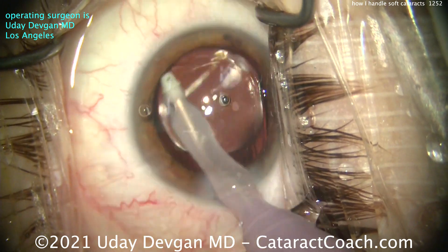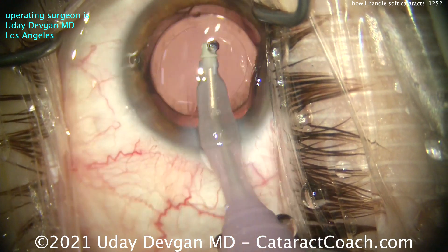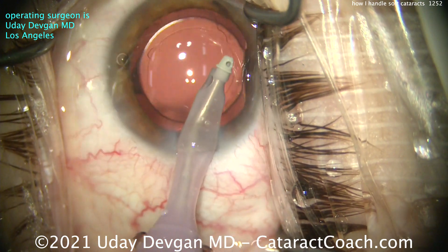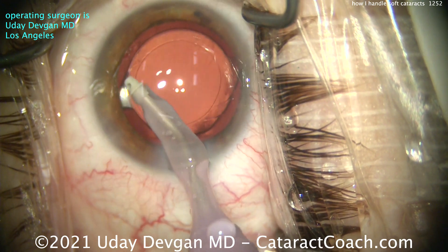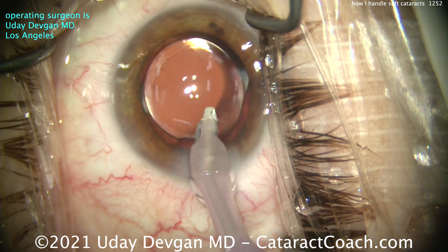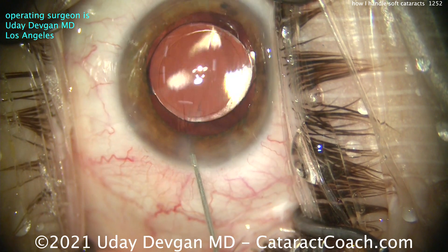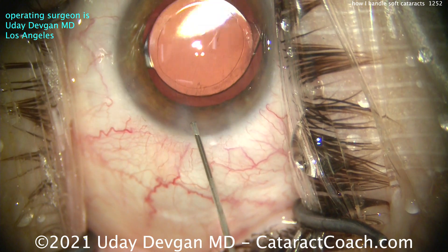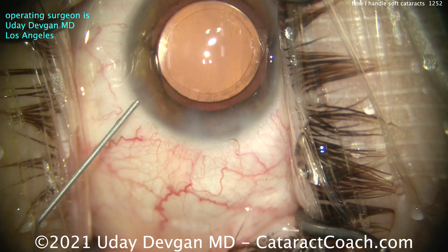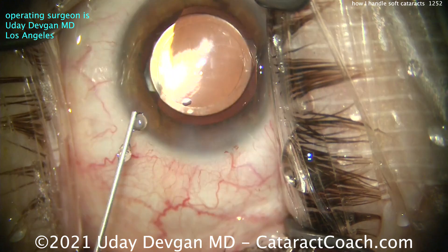Simple case — this is an easy one. Even if you're just starting in practice, you can easily and successfully operate on these patients. Keep in mind the important things: a beautiful incision, a beautiful rhexis to last a patient's lifetime, and get the nucleus out of the capsular bag. You don't want that nucleus sitting in the capsular bag when you're trying to buzz into it. This is the case where you go in with the phaco probe and say 'I'm going to do divide and conquer' — and this nucleus is so soft that on your very first pass for that groove, it hits the posterior capsule. And now you're sunk.